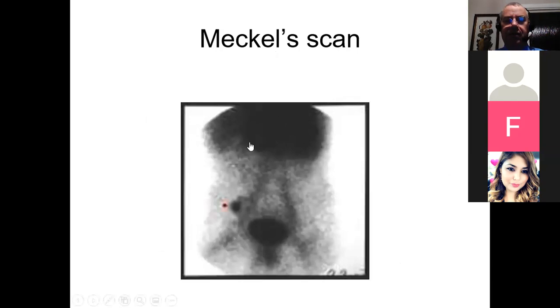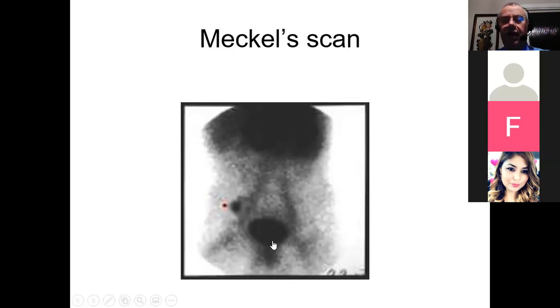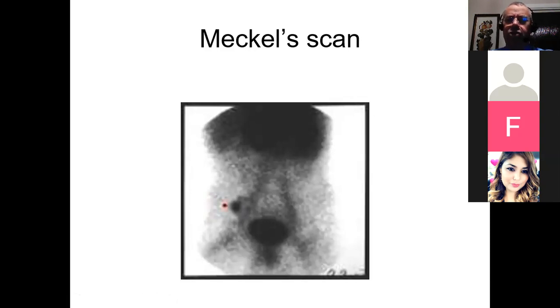Here is a classical positive Meckel's scan. You have activity in the gastric mucosa, some blood pool, urinary activity because pertechnetate is filtered, and then — marked by the red dot — an area away from the line of the ureters and away from the stomach. This would be classically the site of ectopic gastric mucosa. The most common site is the right iliac fossa, where it can symptomatically be confused with appendicitis.